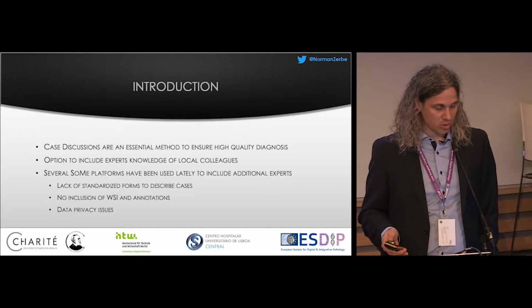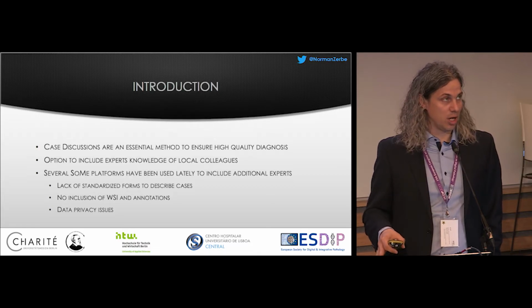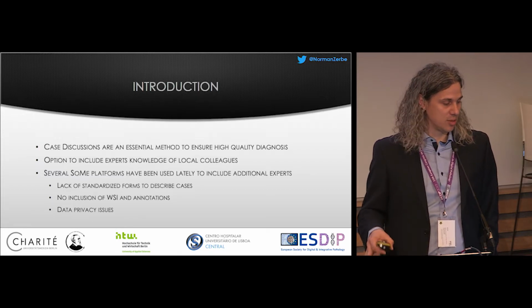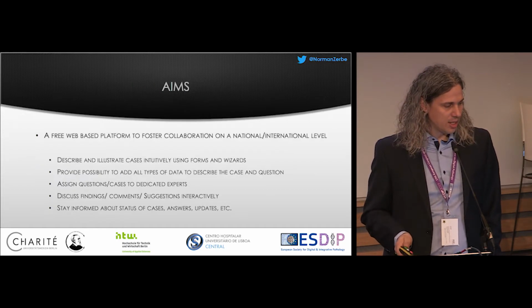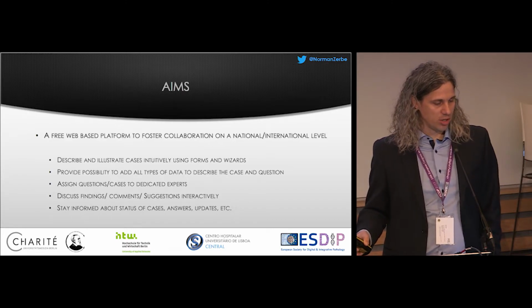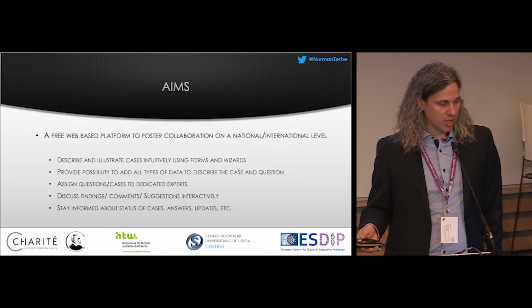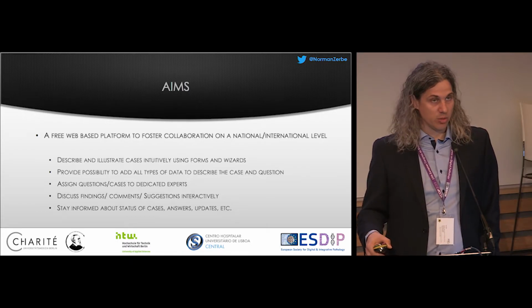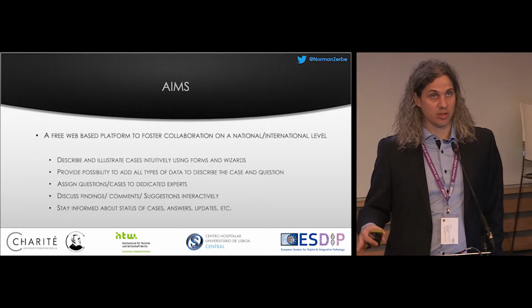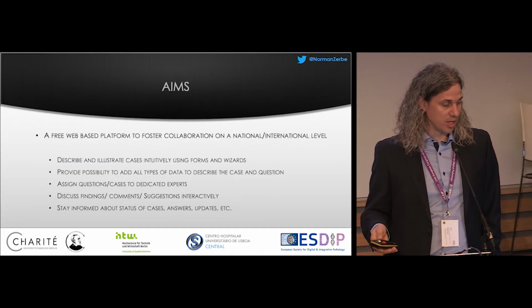So that's why we started to create something which not only removes these data privacy issues, but also allows the inclusion of whole slide images and annotations, and describes the cases in a proper and standardized way. We wanted to create a web-based platform to foster collaboration on a national, but also on an international level. We wanted users to be able to describe and illustrate cases intuitively using forms and wizards, and to add different types of data: whole slide images, but also clinical reports, macro images, and all that you need to describe a case properly.